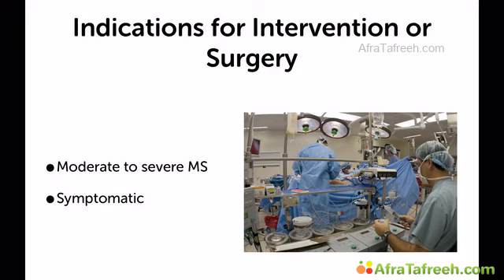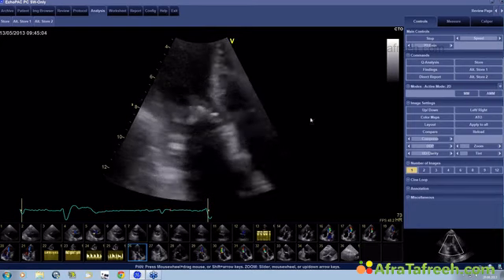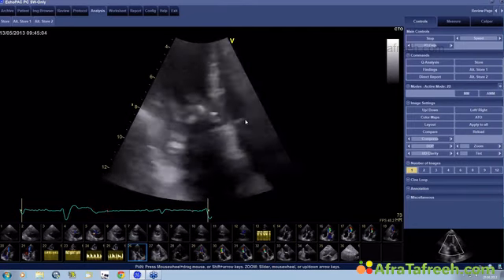So the next thing we will have to do is take a look at the mitral valve in echo and decide if this patient is really suitable for the procedure. We'll just do this right now. And there are certain criteria which you have to look into. And in the workbook, as well as in the lectures, I keep on talking about the so-called Wilkins score or block score. And that takes into account several factors.